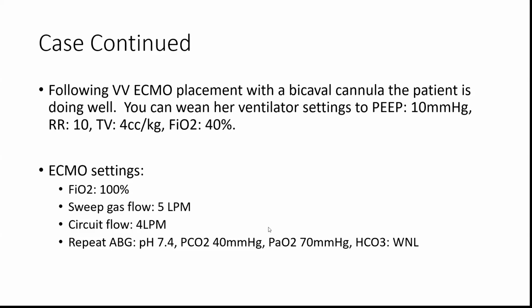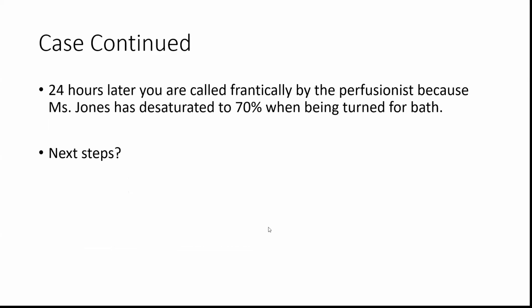Anything else? Everyone else pretty happy? Reedy's very particular, but okay. So everyone else is pretty happy. So I'm happy with that. But I do think that's a good point to titrate the flow down. You want to go as low as you can while supplying the metabolic needs, as I stated.